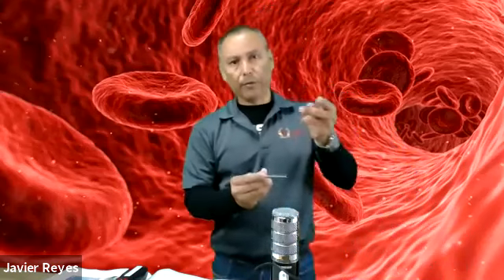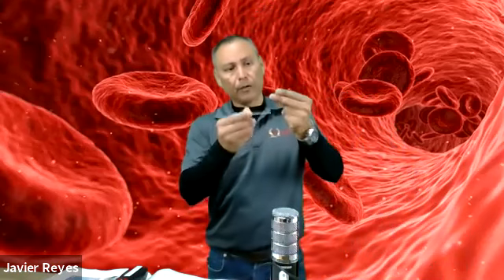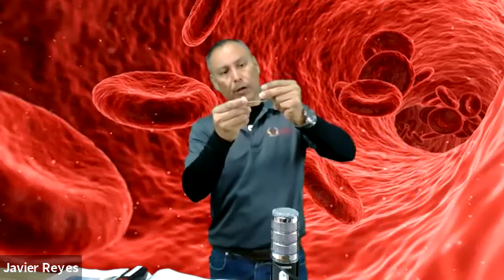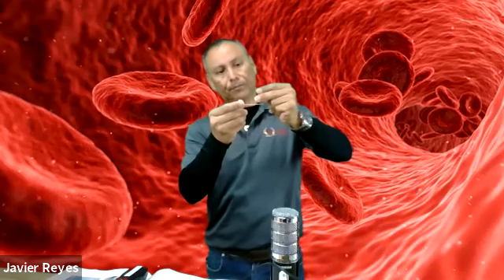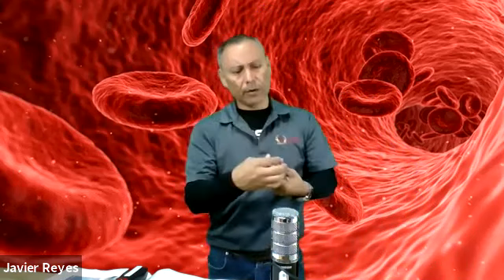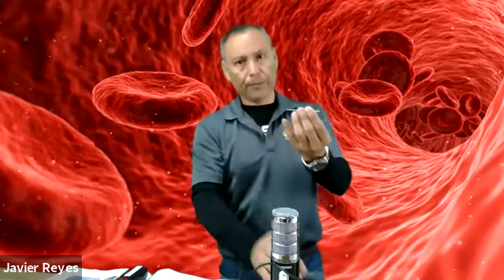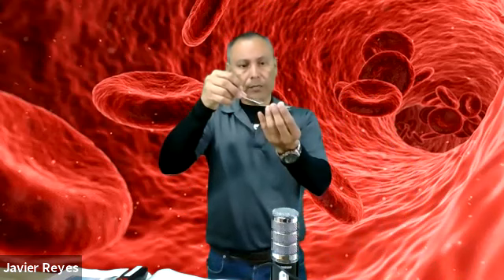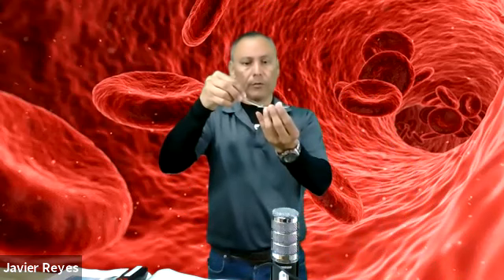Okay, so you have your finger and you're going to be placing your finger right by the slide and the drop will automatically go on there. Okay, once your drop goes on there, you're going to grab another slide. You're going to be bringing it at about 30 degrees and you push your slide there.